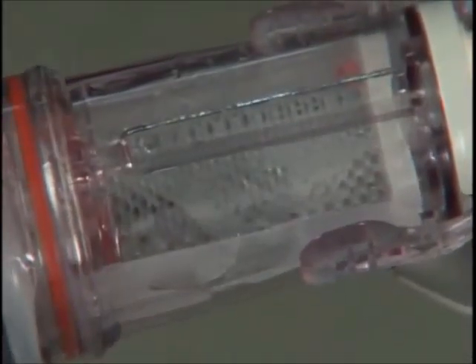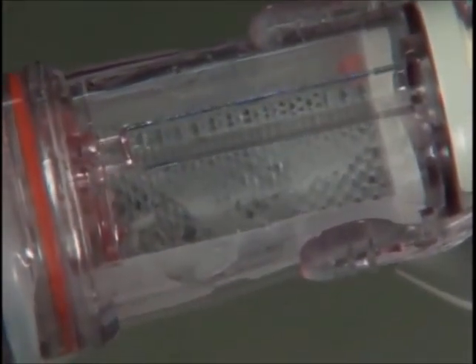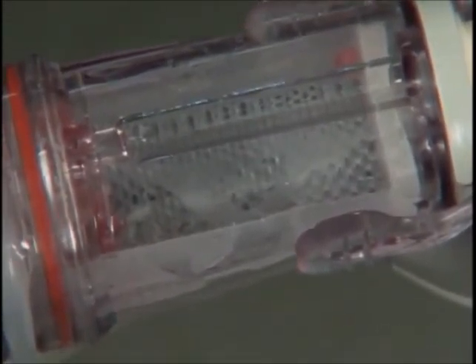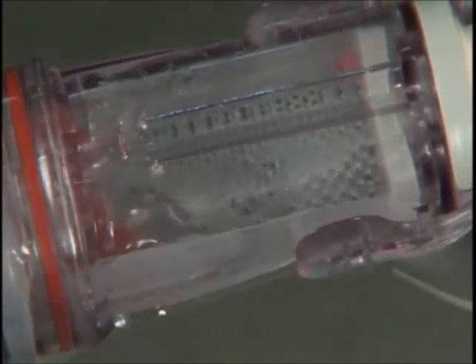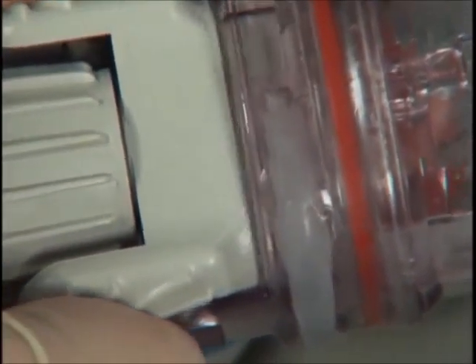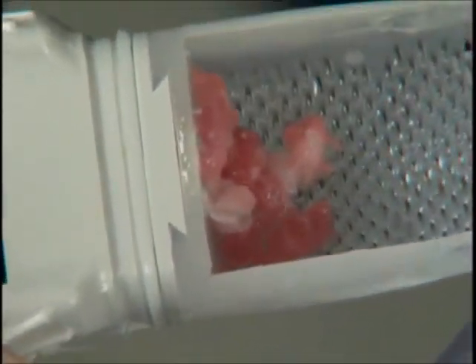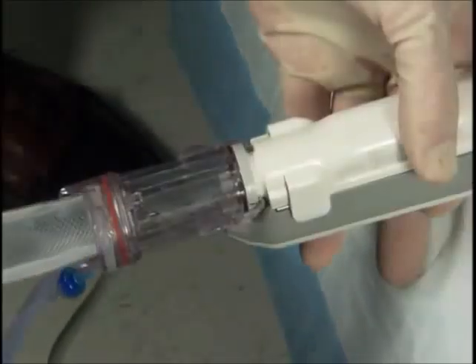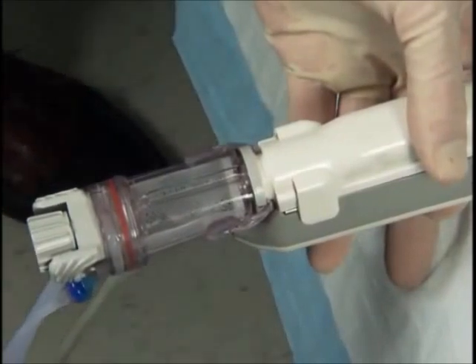When your biopsy is complete, if there's excessive hemorrhage, you can do additional rinsing by pressing the vacuum button on the foot pedal or the handheld device, and then notifying your technologist who will provide additional rinse. Once you've completed your planned biopsy cycle, remove the chamber. You can see the specimen that was obtained collected within the collection chamber. Exchange it for a clean chamber in order to maintain fluid integrity within this closed system.